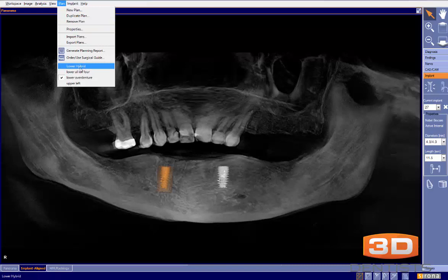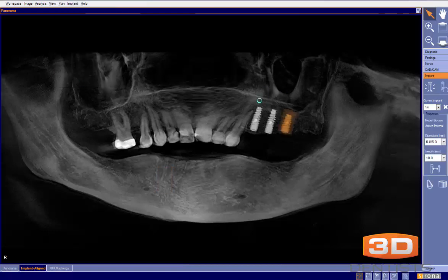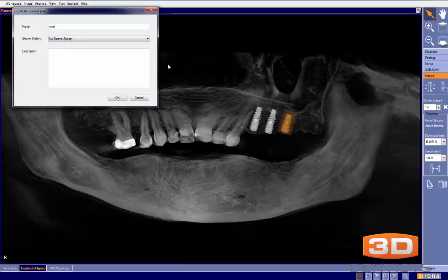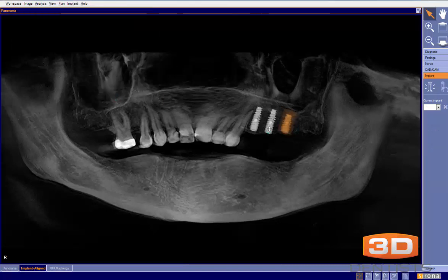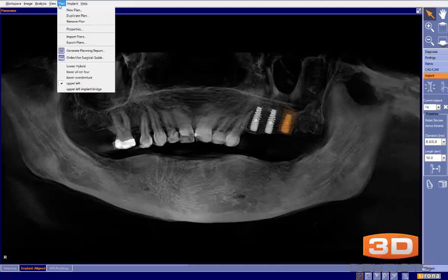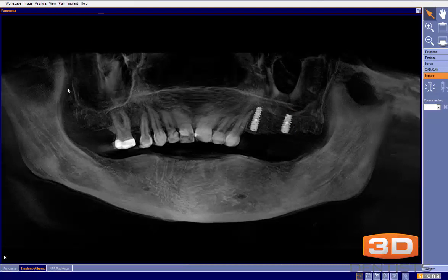As you can see, I have a lower hybrid, a lower all-on-four, a lower overdenture, and I also planned the upper left for three implants. If the patient says financially they don't want that, I come here, go to 'Plan,' 'Duplicate Plan,' and call it 'Upper Left Implant Bridge.' Then I delete one implant. Now I can show her the ideal three-implant option or what a bridge would look like, comparing finances so the patient can make a decision.